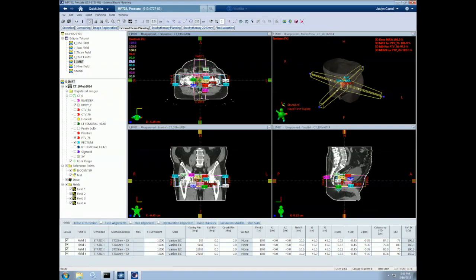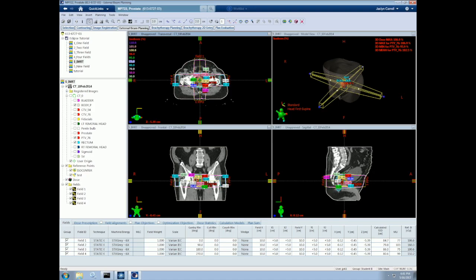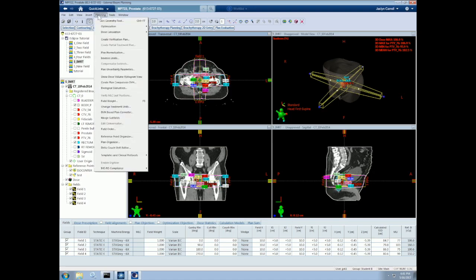We currently have four fields in our plan without MLCs. Once we optimize, MLCs will be automatically added to the beam in order to modulate the fluence. So to optimize, we go to planning and select optimization, and then optimize.